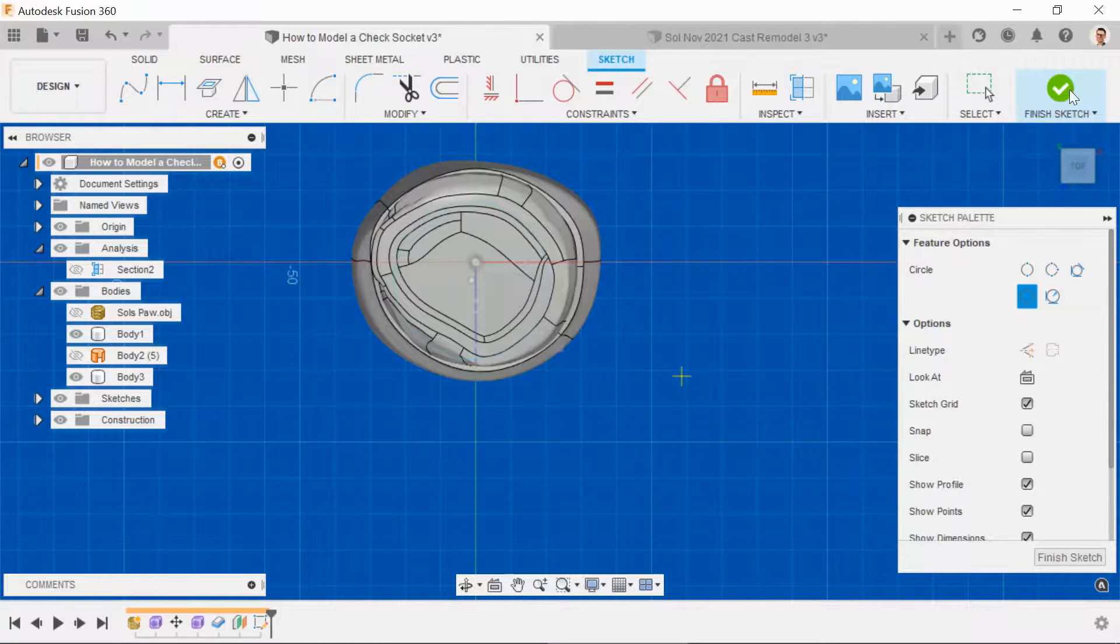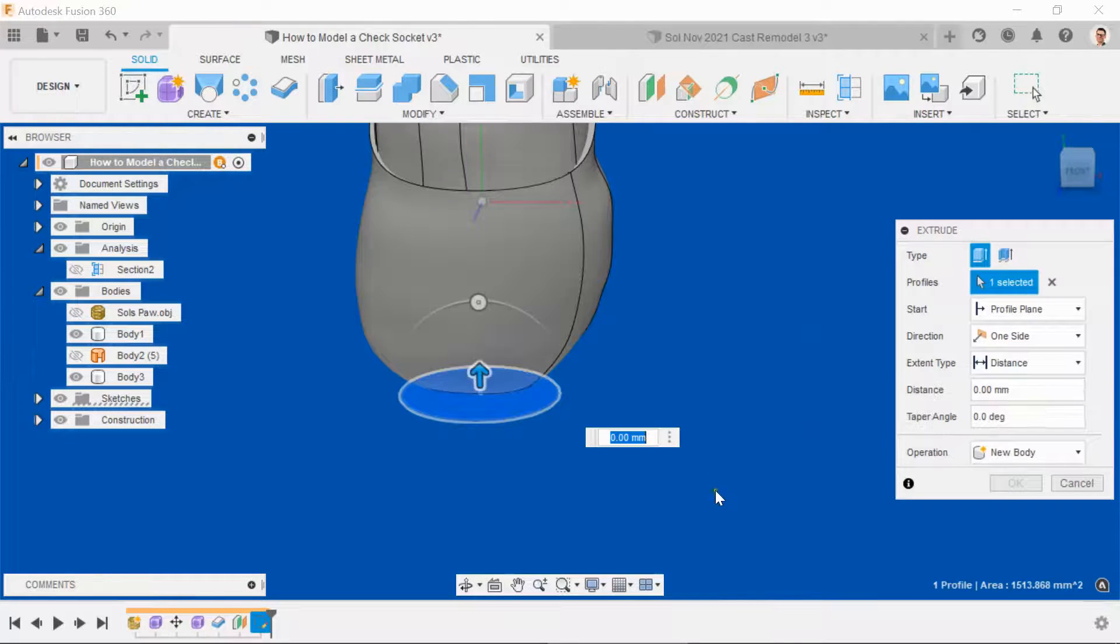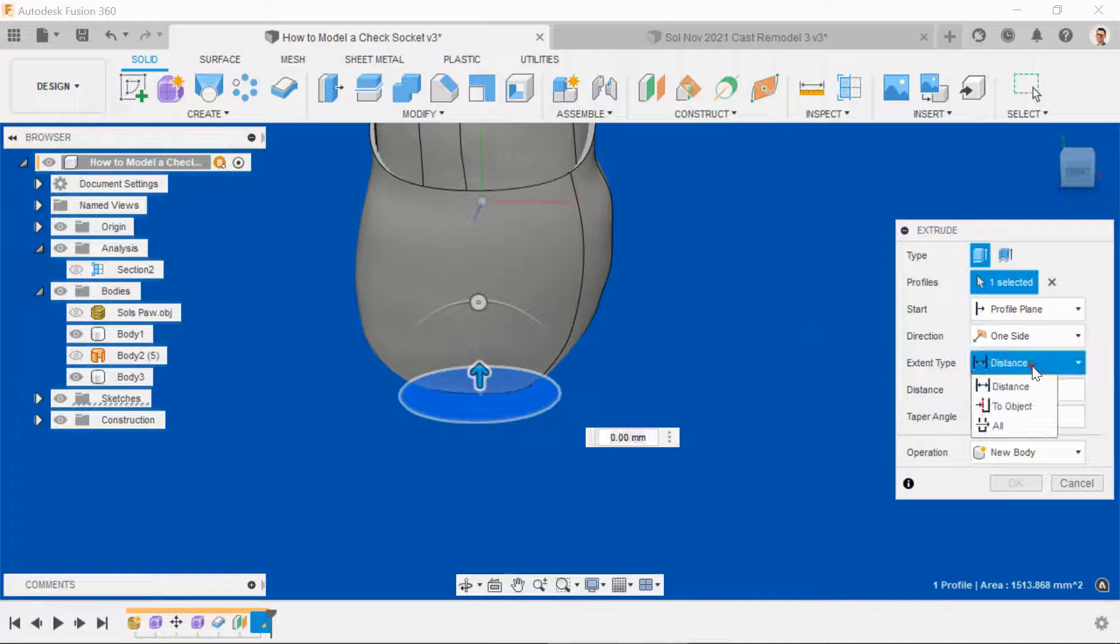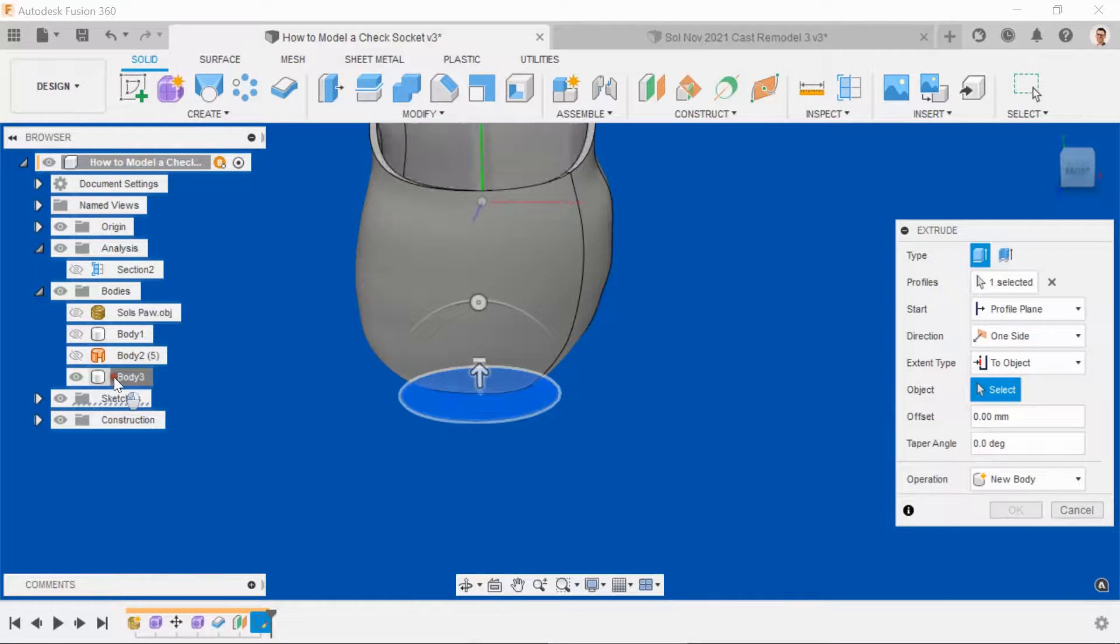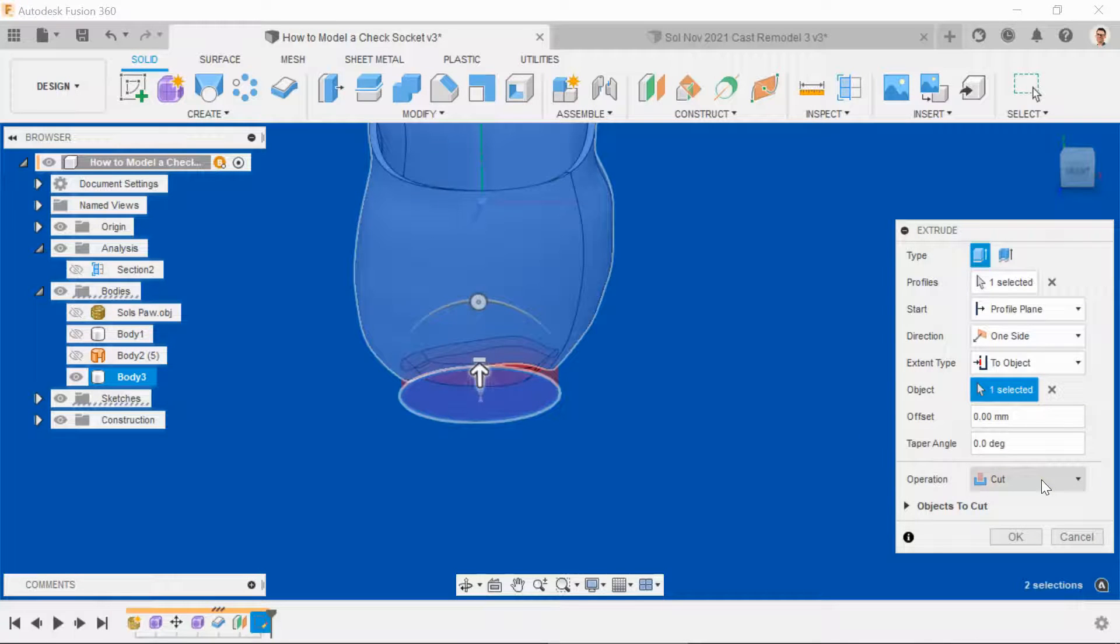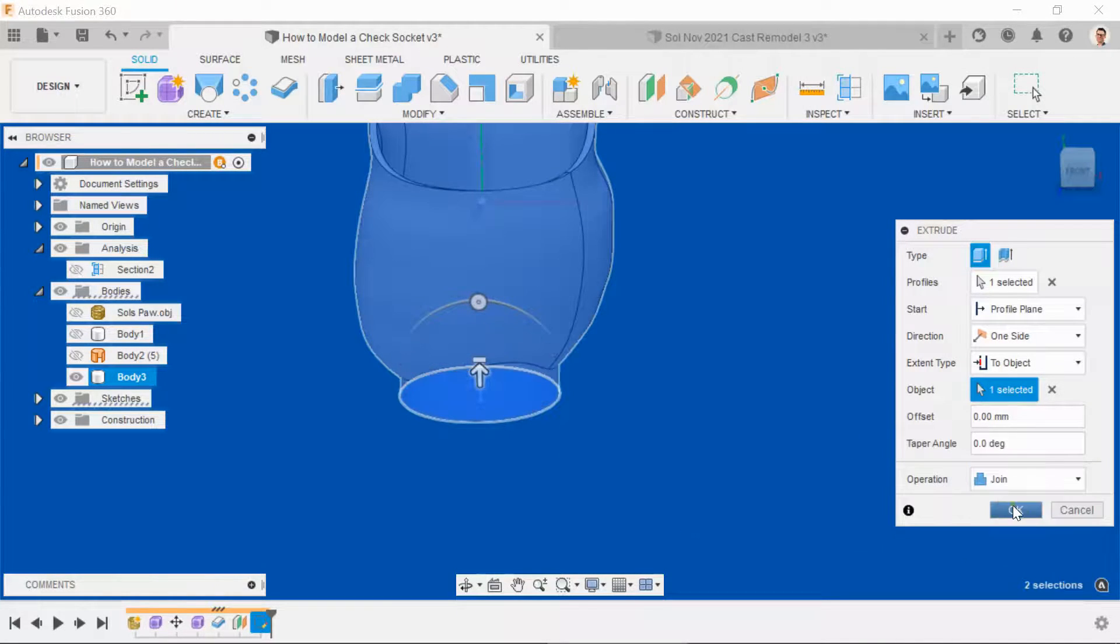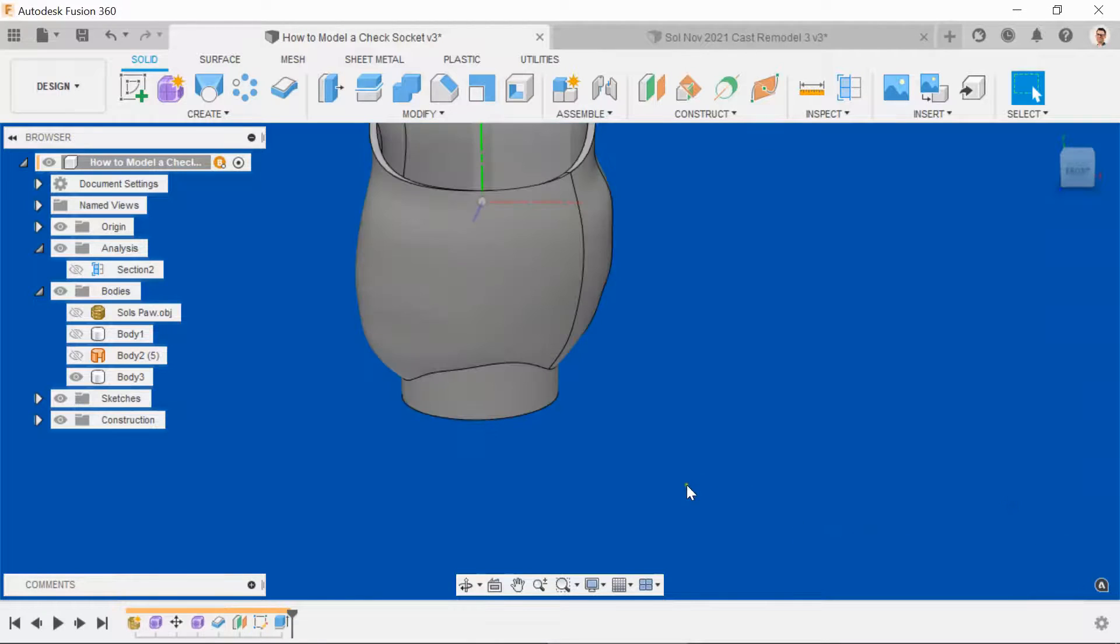Finish the sketch, select the circular profile, press E to extrude, then come to the dialog box and select to object, and select the test socket. For the operation, we want to join rather than cut. Hit OK.